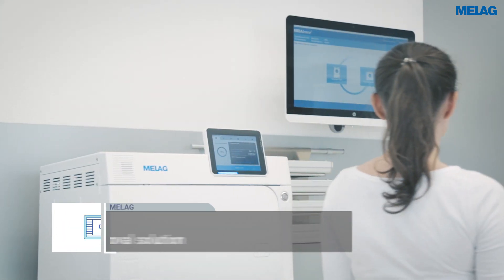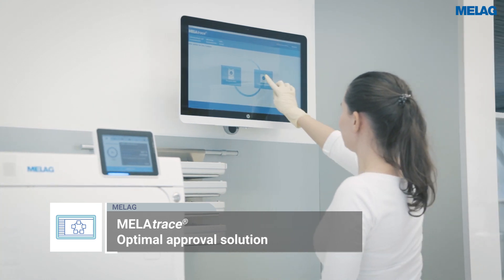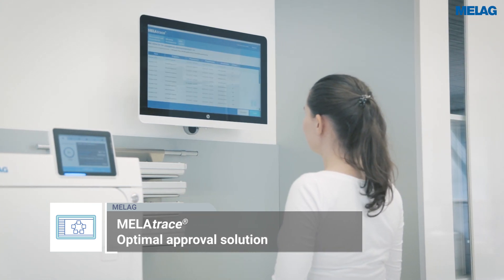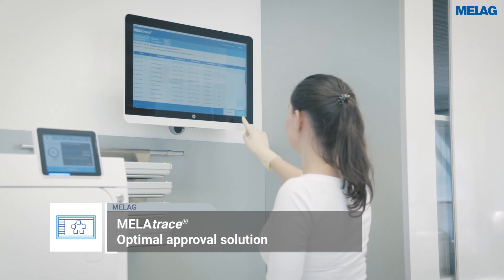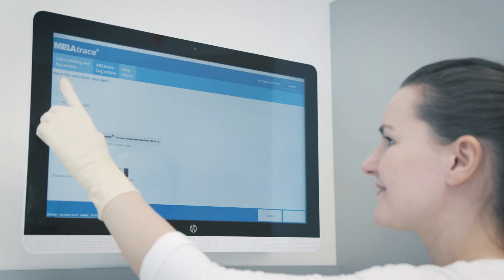The additional documentation and approval software, MELAtrace, links the single steps of cleaning and disinfection with the sterilization to guarantee a complete and comprehensive documentation of the entire decontamination process.